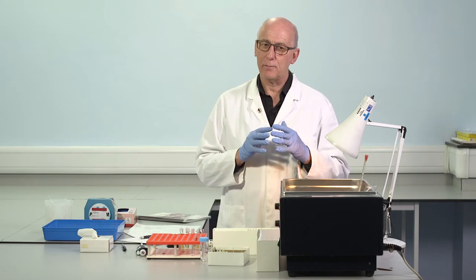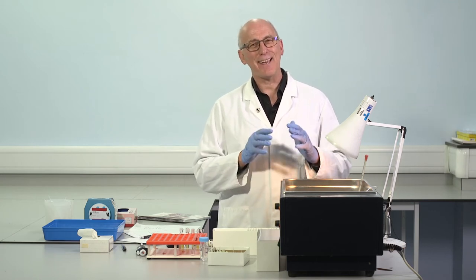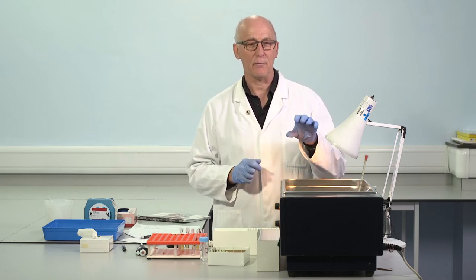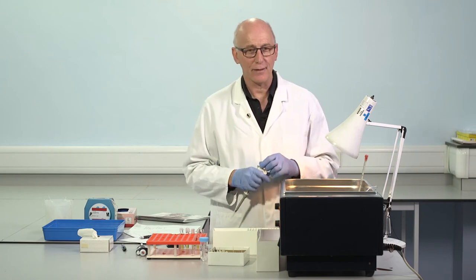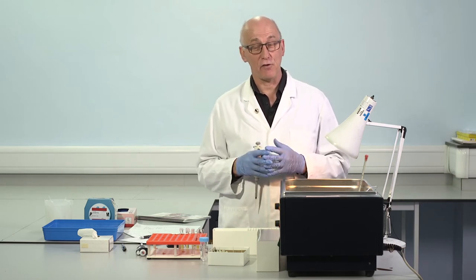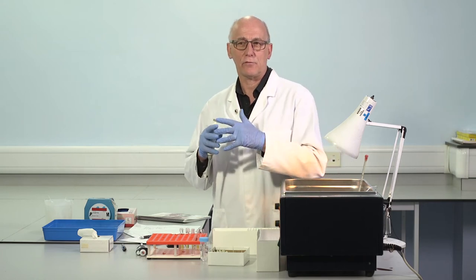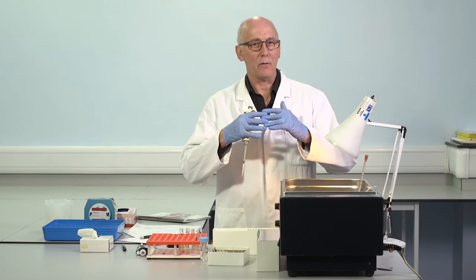We need to differentiate between control and reference range and the functions that they're performing. The control is to tell us, are we getting the same answer today, tomorrow, yesterday, next week? Are we consistent? It's not really to tell us normal or abnormal. It's simply telling us we're under control, that the method is precise. So if we make a normal control, it's frequently somewhere within the normal range. Depends how it's made. It's possible, particularly for freeze-dried materials where there is more manipulation. If it's a very large volume, for example, there can be changes in the levels of clotting factors during that processing, so that once the control is prepared, the result may not always be, it's very rarely within the middle of the reference range.